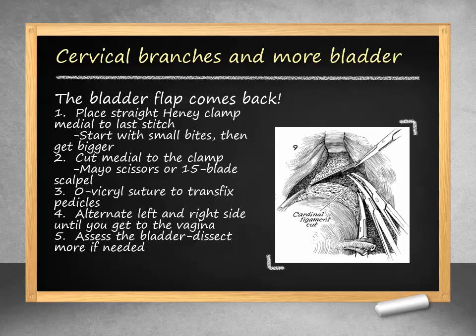We now must isolate and ligate the cervical branches of the uterine artery. This is accomplished with straight Heaney clamps, with placement of each clamp medial to the previous stitch. Once a clamp is placed, you then cut medial to the clamp with either Mayo scissors or a scalpel. Vicryl suture is used to secure the pedicles with placement of the suture at the tip of the clamp and tied behind the clamp. You will alternate with your assistant until you reach the vagina. During this process, continue to check the bladder and mobilize further if needed.